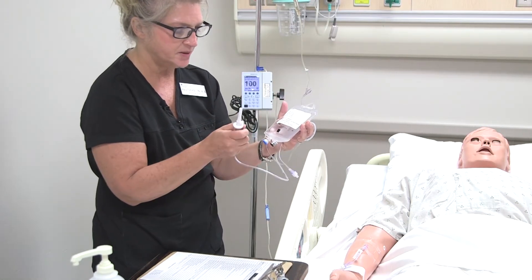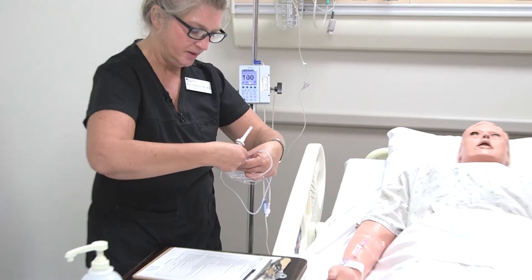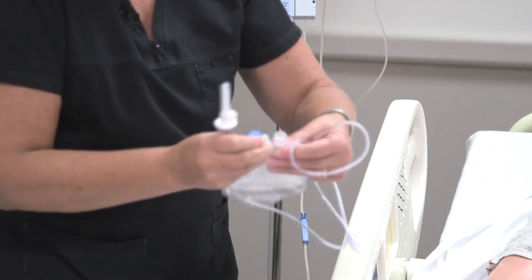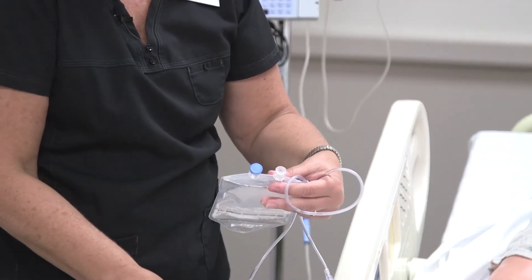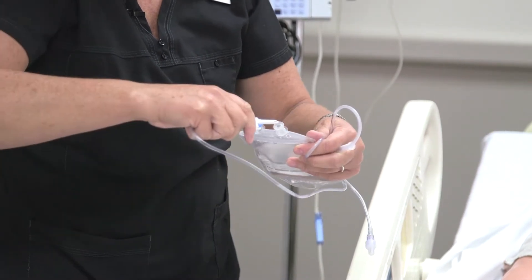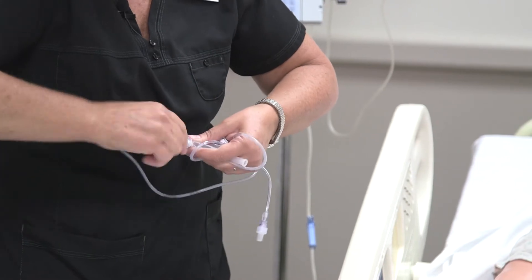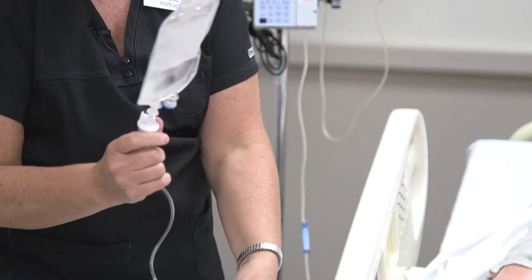This is the port that you're going to put the spike in. Once again, you want to make sure that when you open this, you don't touch it — keep it sterile — and the same with the spike, keep that sterile. So you put that right in there, and sometimes you have to kind of twist it in.